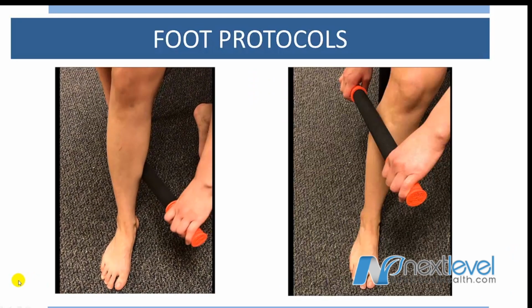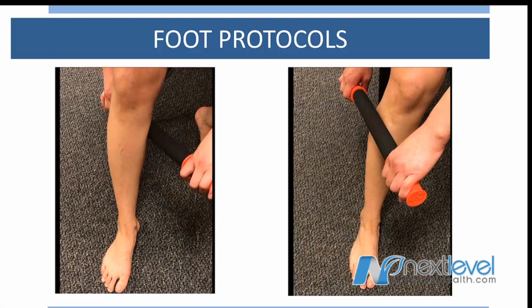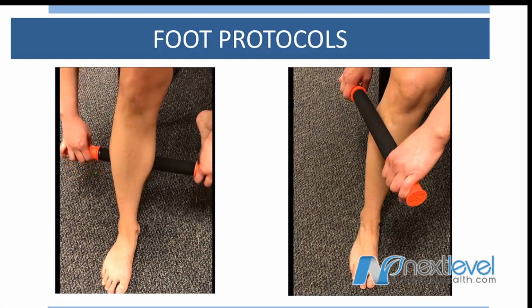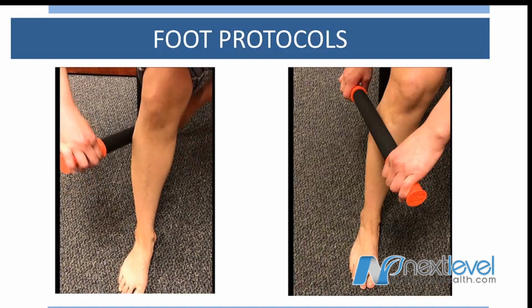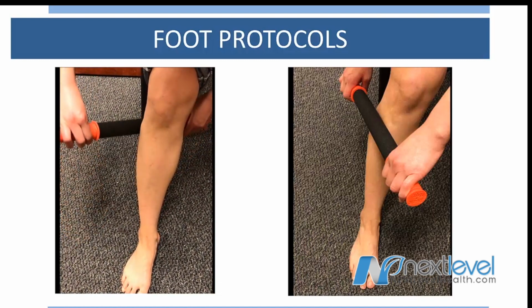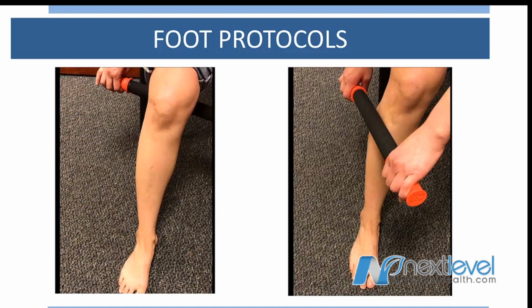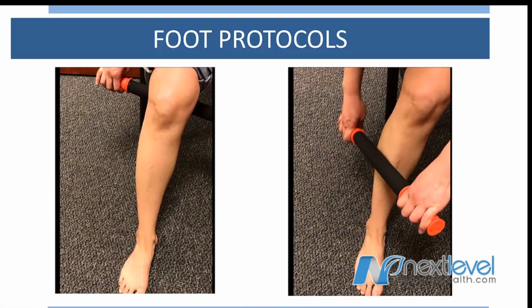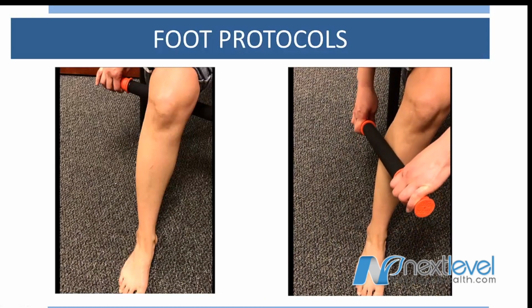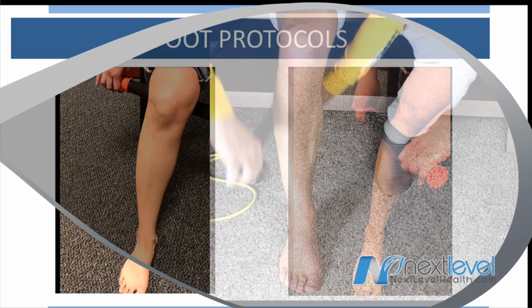Then you're going to work on the back of your calves. So you're going to work on the inside of the calf, the middle of the calf, or the back, and then the outside of the calf. The last position is going to be the outside front of your shin. And when you're doing this, you shouldn't roll it over any bone. Bone will not feel good. It will hurt. You should only feel like it's rolling over muscle.